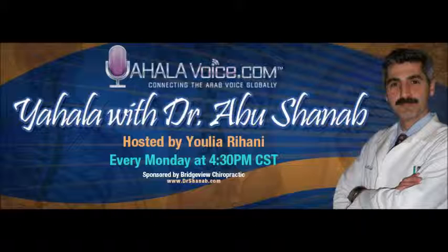All right, then we're going to refocus on patients with cancer. We talked about patients who have a pacemaker, patients who have an aneurysm in the brain. But how about patients with cancers? Will MRI be the method, or should we look at a CT or an ultrasound? What do you mostly see that's common? Okay, it depends where the cancer is. If we are looking for a primary cancer in the brain, MRI is the gold standard, and it should be done with and without intravenous contrast. Even if it's a distant cancer, like in the lungs or kidneys, these cancers do tend to metastasize or form secondary deposits in the brain. Even for those conditions, we do need contrast.